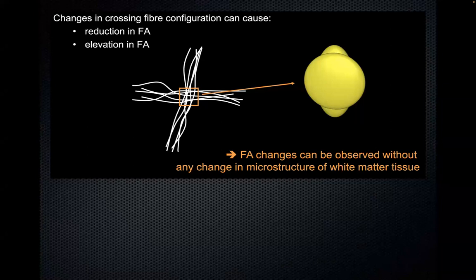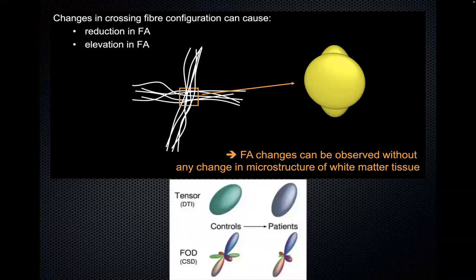So if suddenly we have disease, and that was my tentative here, 1 fascicle is healthy, but just the second one is deteriorating. This is troubling a lot of DTI people, but you can actually see that this tensor here in the patient is actually more anisotropic. This is FA increasing with disease.